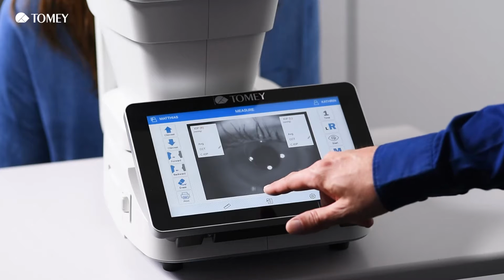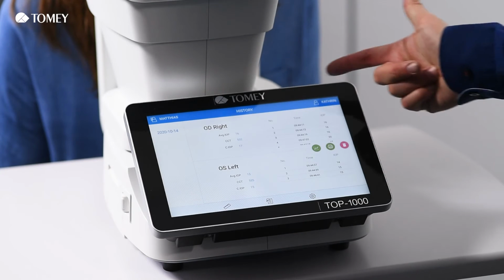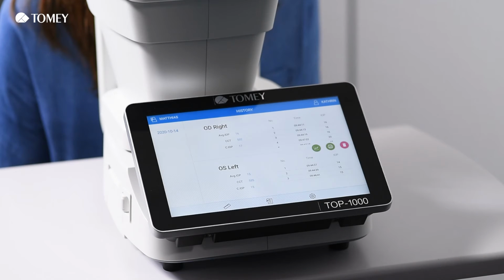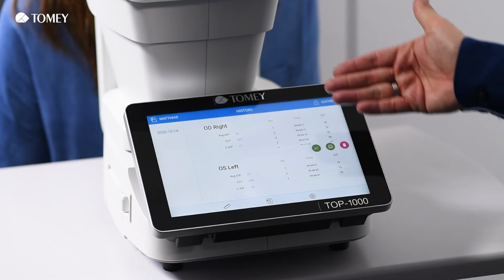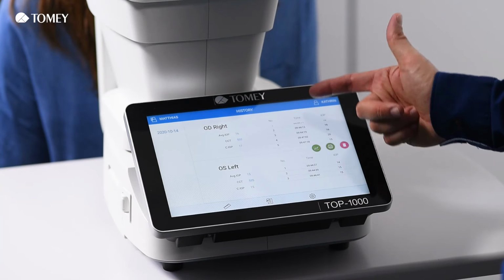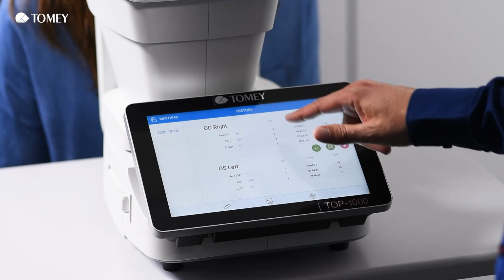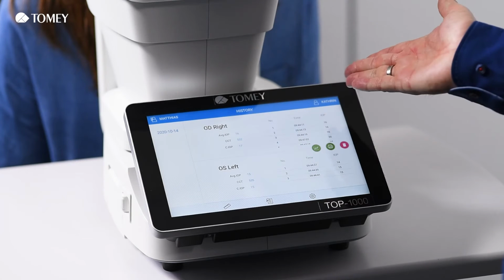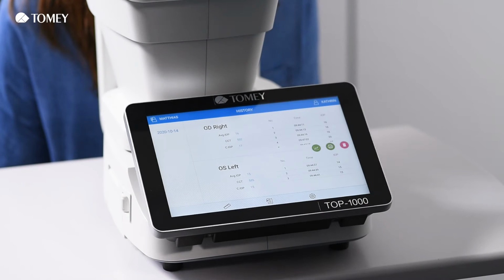So then we've done a measurement. Let's take a look at the patient database. So for this, we go there. And now we are in the folder of Catherine, and we see all the measurements, how many measurements are performed. In this case, 5 measurements for the right eye because we did 2 manual measurements. We have the average, it's 16. We have the corrected value, and we have the CCT value as well printed.